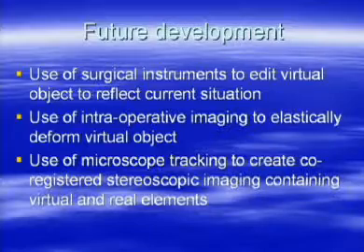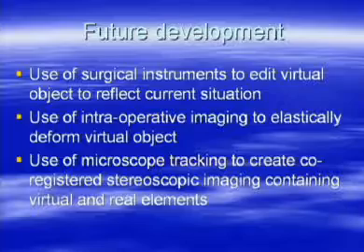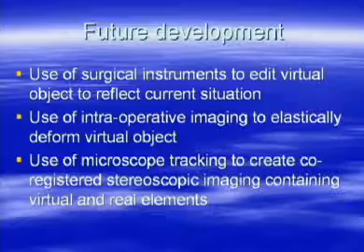What we would like to do with future developments of this device is to actually use the surgical instruments as they're being tracked in the operating room to, again, edit the virtual object, just like the virtual objects on the current Dextroscope, so that we can actually reflect the current situation in terms of tumor resection using the surgical instruments as pointers in the virtual world.